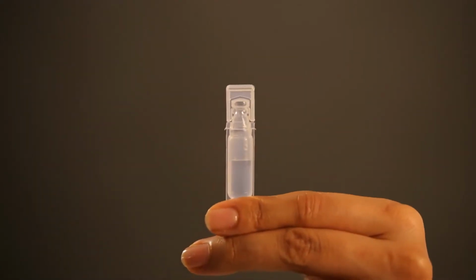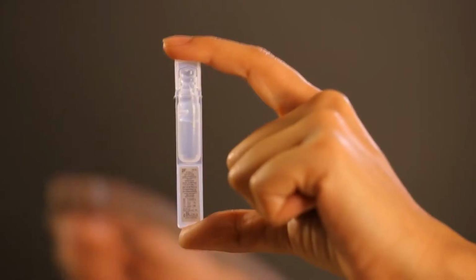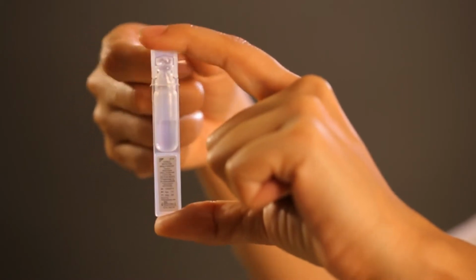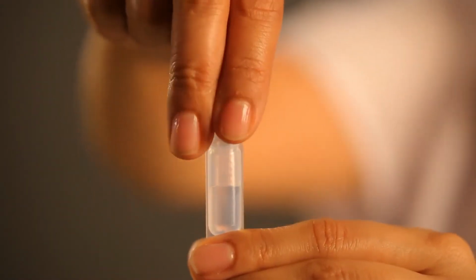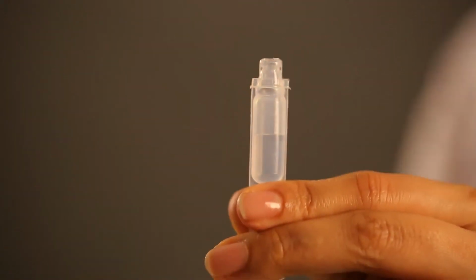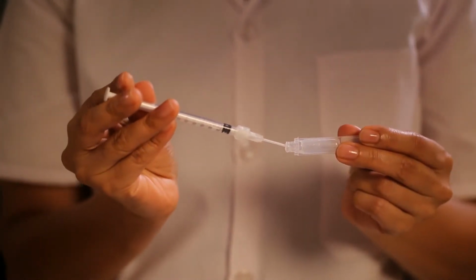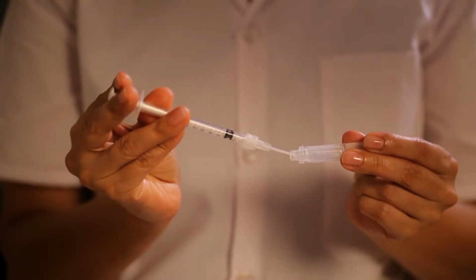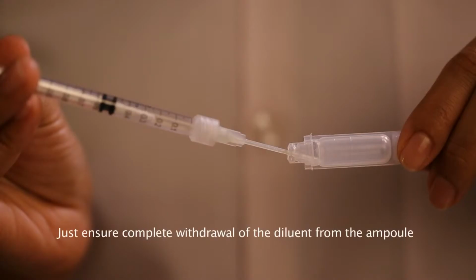Visually examine if there is any diluent trapped in the top of the ampule. Tap the ampule to ensure that the diluent trapped at the top descends into the ampule body. Open the ampule by twisting off the top and draw the entire contents into the syringe by tilting the ampule. It does not matter if there are any air bubbles in the diluent. Just ensure complete withdrawal of the diluent from the ampule.